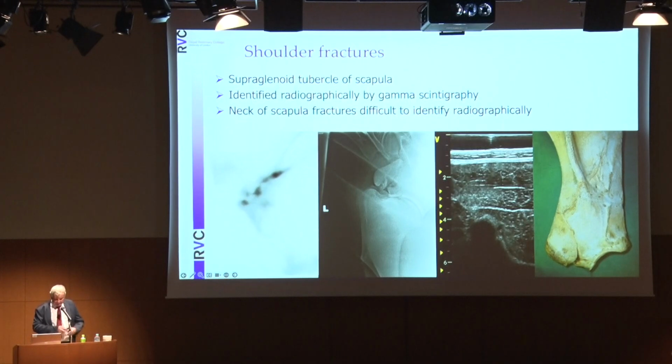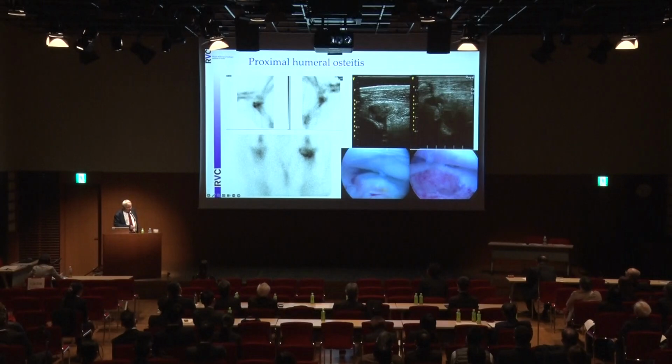And this was identifiable on ultrasound, but only after we knew that it was there.